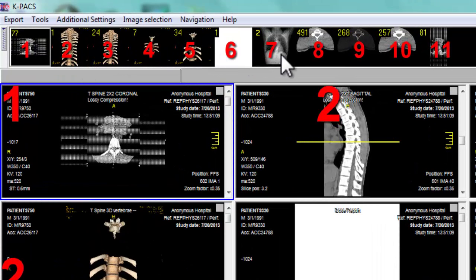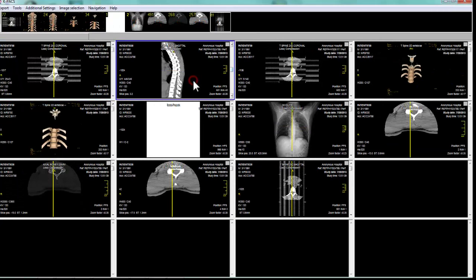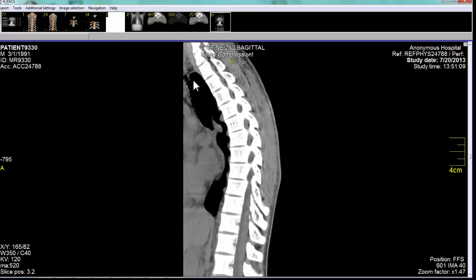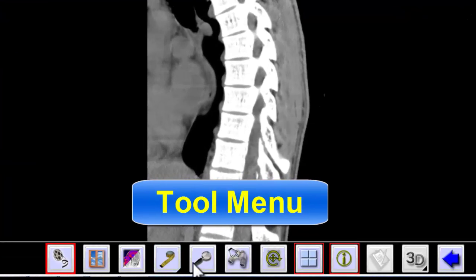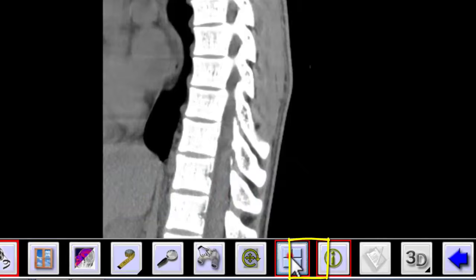To go from one screen to sixteen screens, or any makeup of the sixteen possible screens, the first thing I've got to do is move my cursor to the bottom of the computer screen until the pop-up menu of the tools appears. Then I move my cursor to the tile screen icon and click on it, and then I have the menu for tile screens.